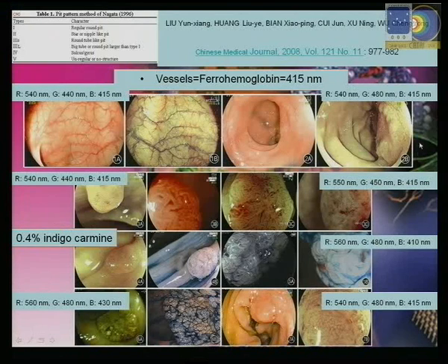Here is one of the cases of chromoendoscopy. It is clear that without changing the wavelength, you see less than when changing the wavelength, you see more. In this case, it's not a problem because it's just to see more or less the vessels, but obviously it's much more marked here, and the only difference is just the color excitation of the light, yes.